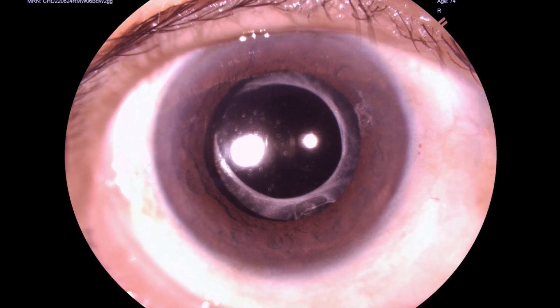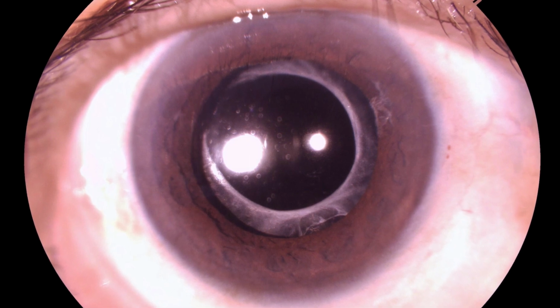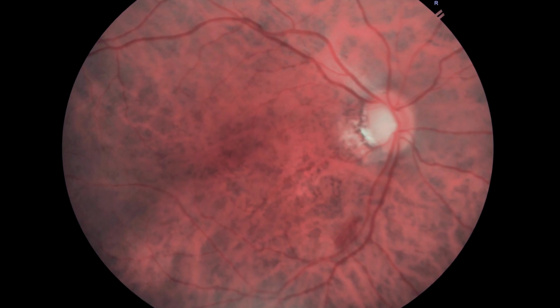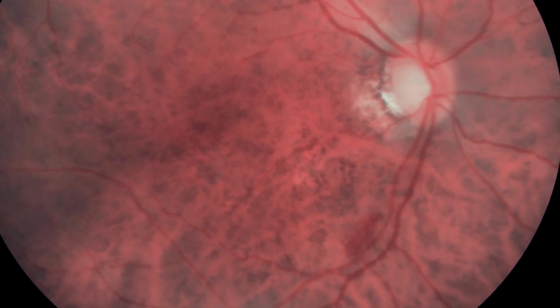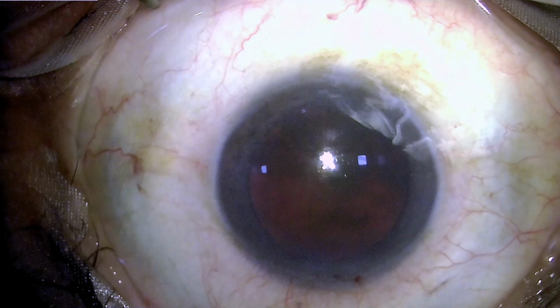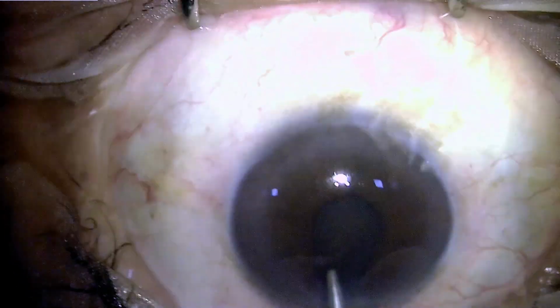fundus was normal. And this is the other eye which was pseudophakic, showing some amount of peripheral anterior capsular opacity and some amount of phimosis. This was the fundus which showed a splinter hemorrhage away from the disc and a suspicious cup, although the IOP was very much normal. So we proceeded for the phacoemulsification surgery for this eye, which was planned for cataract surgery and IOL implantation because of visually significant cataract.